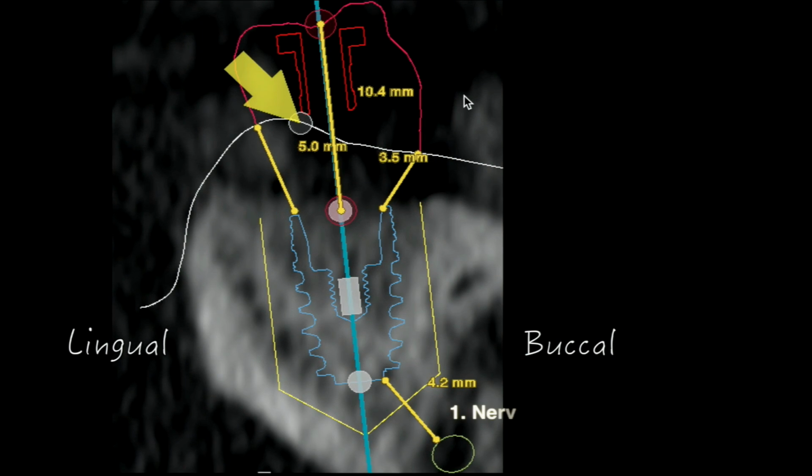We're coming from an implant that is 5.5 on the outside, 5.1 on the inside, so 5.1 out to 11 or 12 millimeters, we get this ideal emergence, particularly if we have the implant at the right depth. If we just go bone level, we won't have the right depth. So let's look again one more time at this particular case.